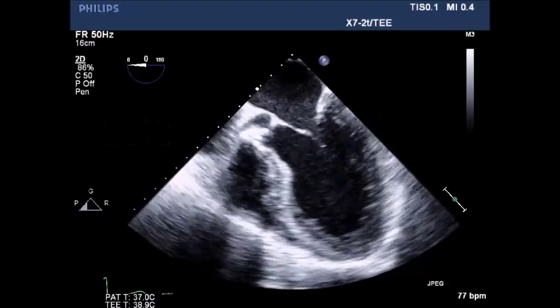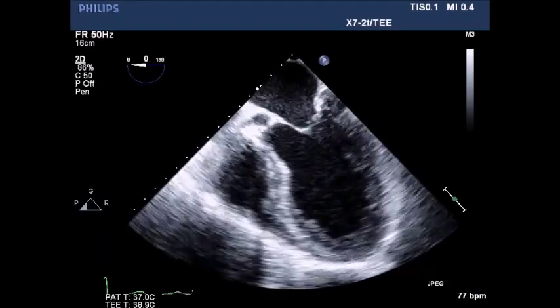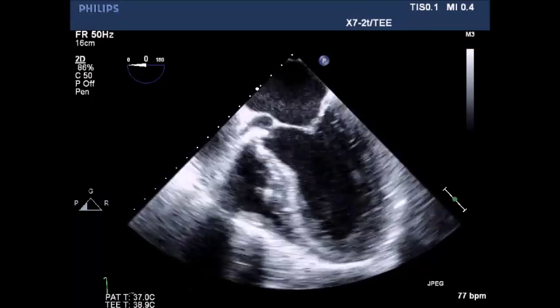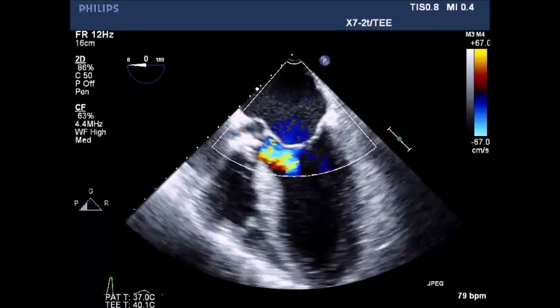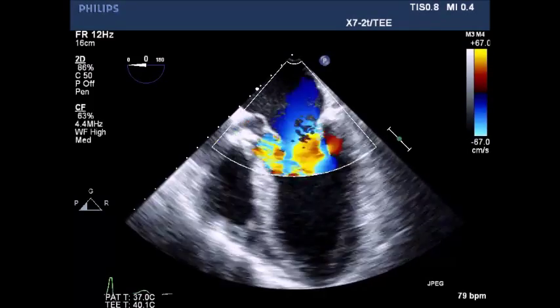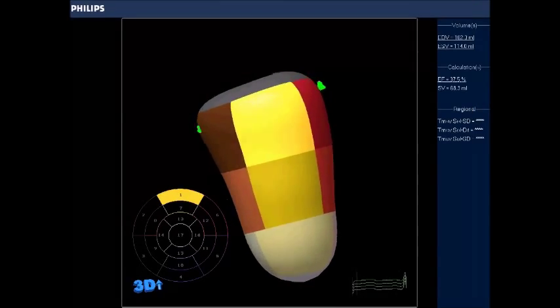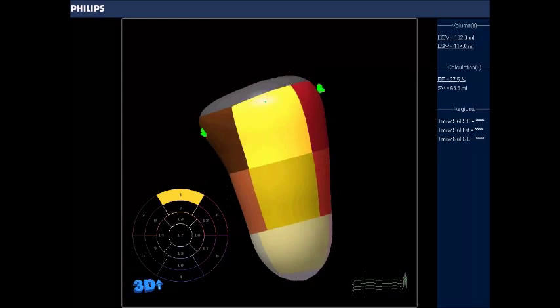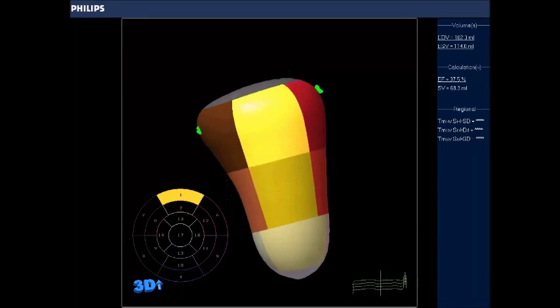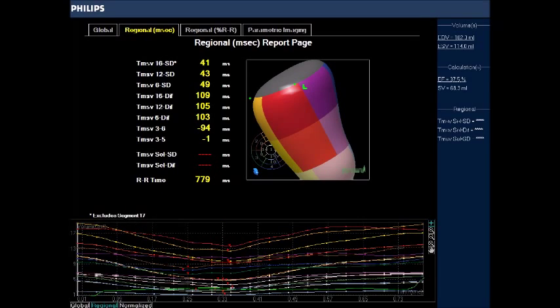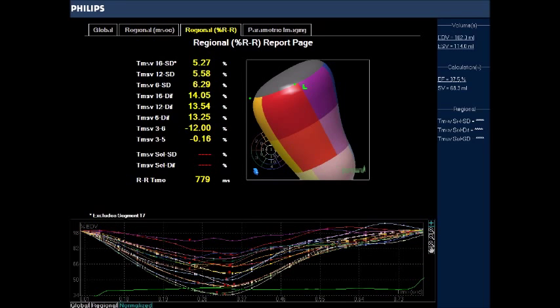Analysis of the left ventricle in the 5-chamber view, noting dilated LV and left atrium, and decreased contractility. Color flow Doppler in the LVOT demonstrates aortic insufficiency. EF is approximately 37% with a normal stroke volume due to cavity dilation — stroke volume around 70 milliliters.